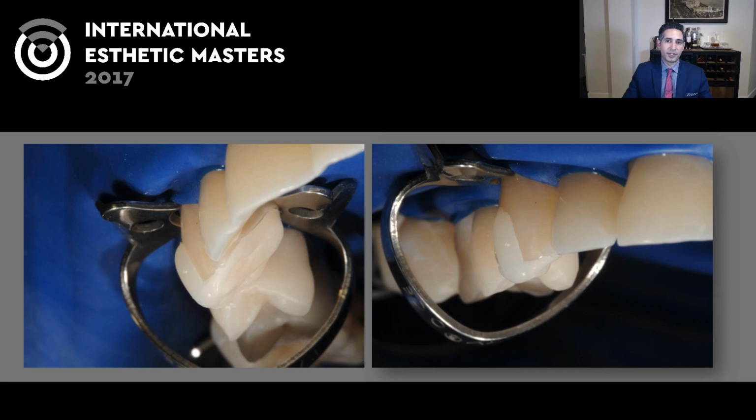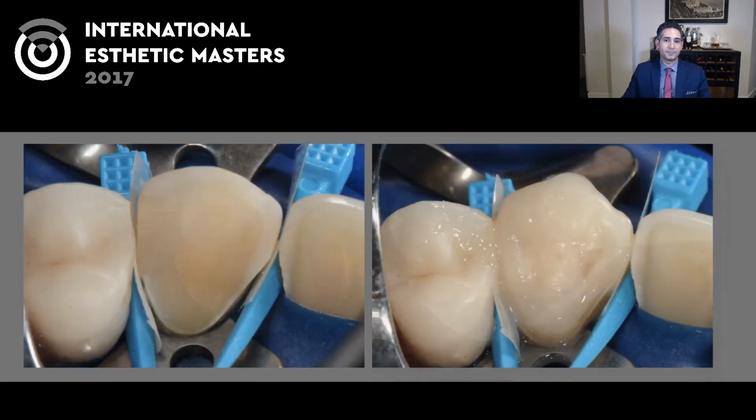If the restoration isn't seating, you have time to figure out what's going on and still make sure everything gets into place. Also, nothing's better than composite on these restorations because it gives you a margin in composite. It gives you the strongest bond because the modulus of this material helps create a stronger bond, and it's very polishable at the margin. So these are all good reasons to use composite. And by the way, cleanup is a lot easier than using Panavia or something like that. So whenever I can, I like to use composite and minimize using traditional cements or resin cements.